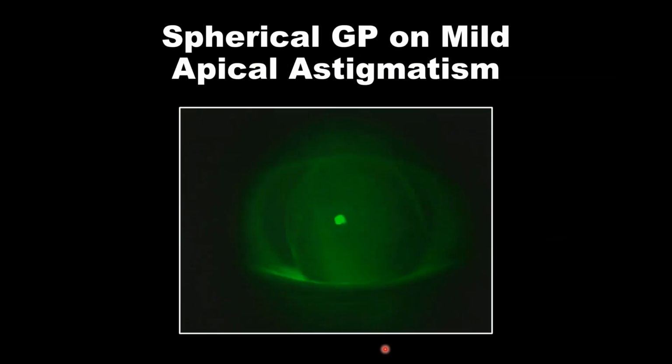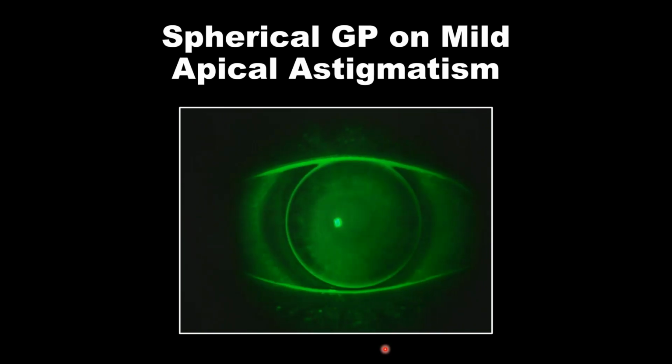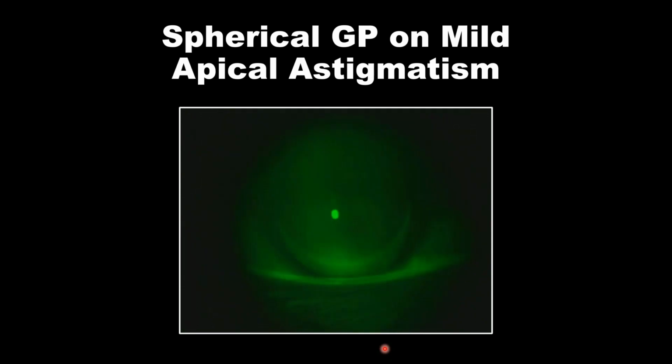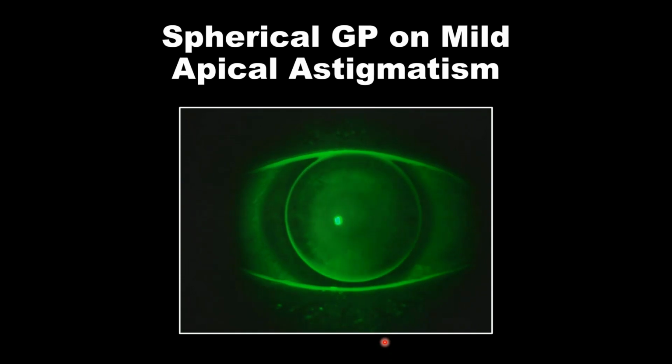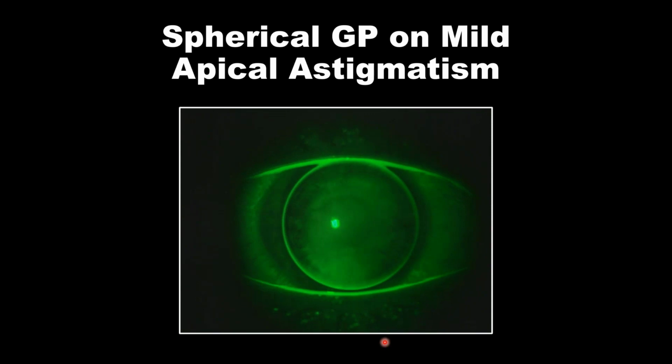Let's look at the lens on eye. Because this is a low corneal astigmatism, because it's a low sagittal differential between the flat and the steep, we have a pretty good fitting lens. We have a lens that lands at 3 and 9 o'clock. The relationship across the flat is really good. Across the vertical, we have a little bit of a channel, 33 microns at 12 and 6 o'clock, for that lens to freely move across that steep axis of the eye, and good tear exchange will be promoted by the lid force and the gravity that's up and down. So this is ideal. Now, what about this patient?